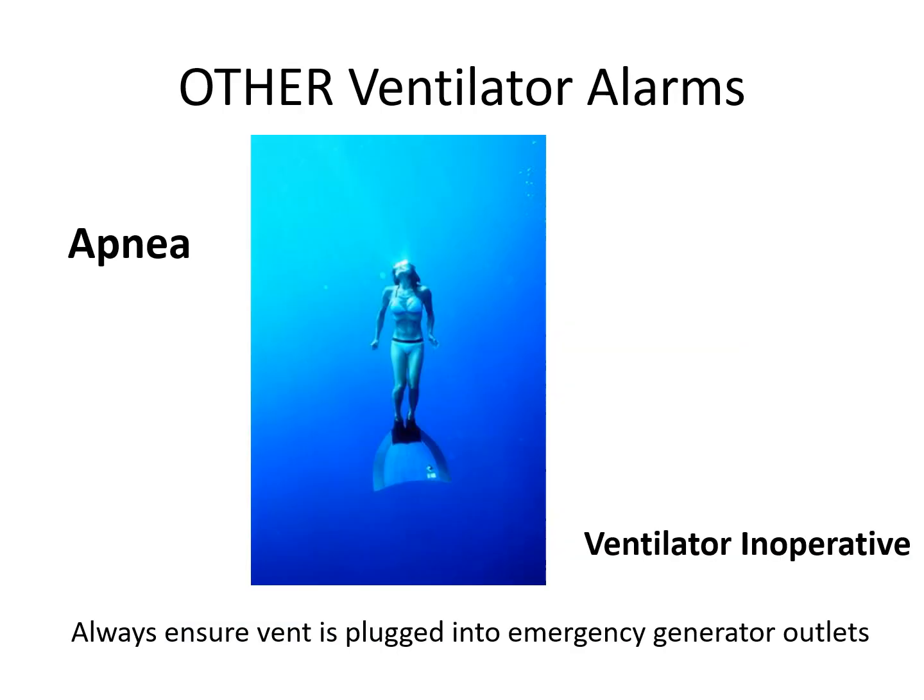Other ventilator alarms, so an apnea alarm. If your patient is weaning and they're on a PSV or CPAP, you would definitely want to make sure that you alert if the patient's not breathing anymore, they need to go back on their full support setting.